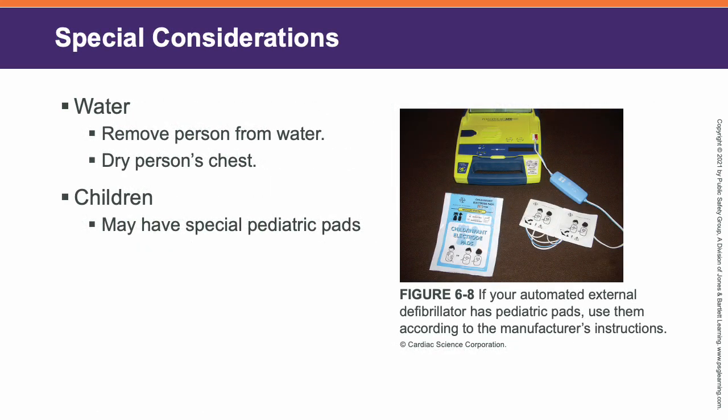So some things to consider when it comes to the AED. First, if the person is wet, or if they're in a large body of water, you want to remove them from the water. If they're in a lake or a pool, you're not going to put it on them while they're in that large body of water. Now, if they're in a little puddle, that's okay.